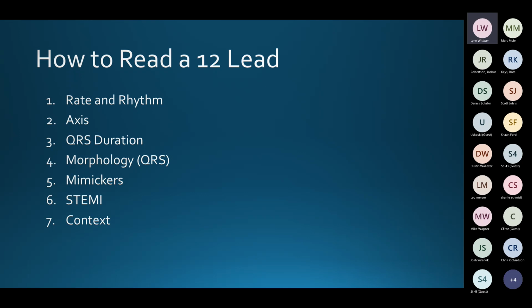And then the most important one, I will continue to come back on this one. What is the context in which you are doing the electrocardiogram? By this, I mean, are you doing this electrocardiogram because the person is a 55-year-old male who has a family history of heart disease, who is now having crushing substernal chest pain radiating to his jaw and to his left shoulder? Is he diaphoretic? Is he having shortness of breath, etc.? That is more likely, so if you read your 12 lead and it looks like a STEMI, that's probably what it is.